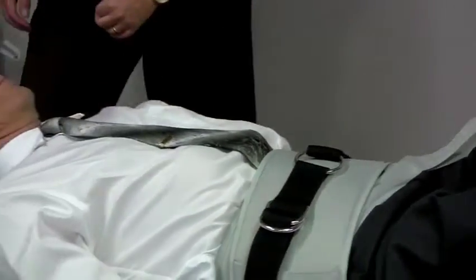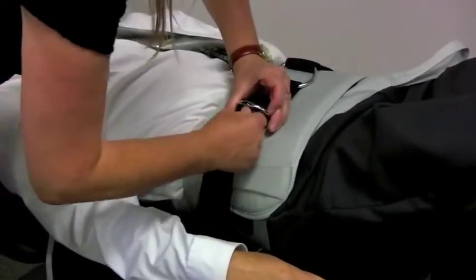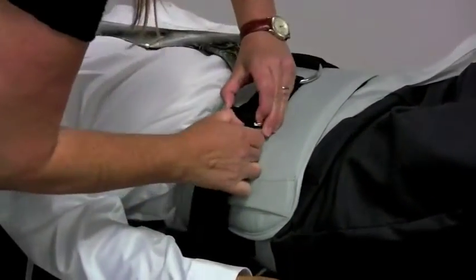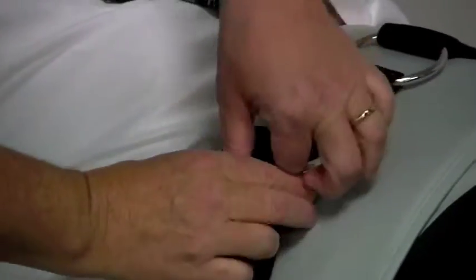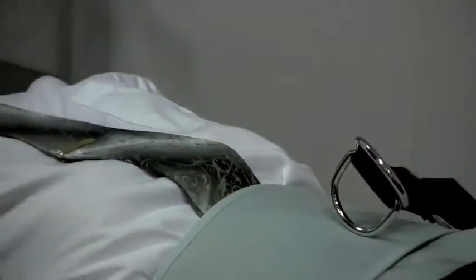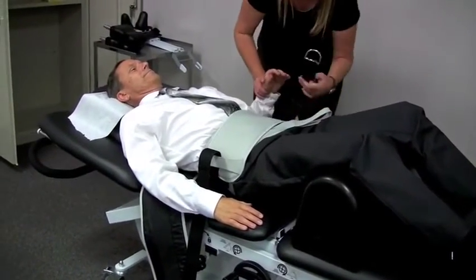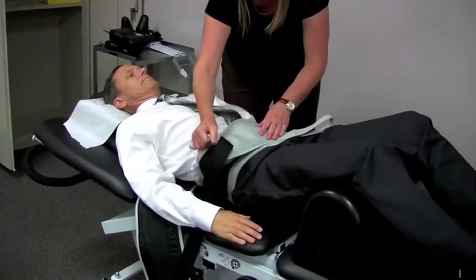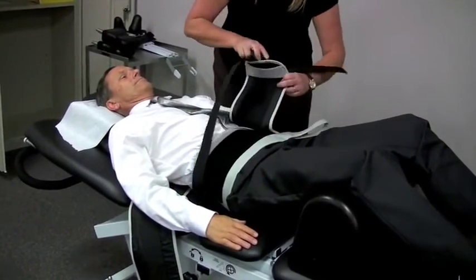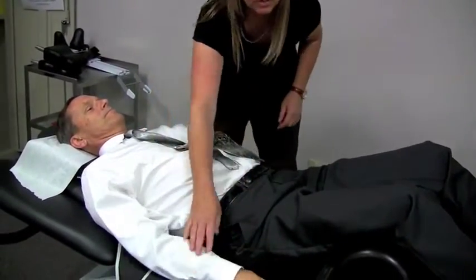There we go. And then I'm going to come to this side so I don't jostle you around too much. Loosen this up. As this gets more used, this strap will soften and be easier to slip through the rings. This next part's kind of important to not just, again, let him free. Do anything too fast. Put that there. And just let the patient get used to it.